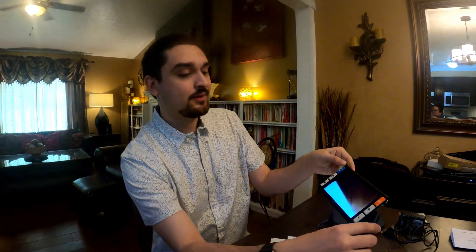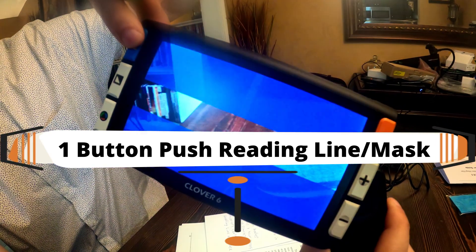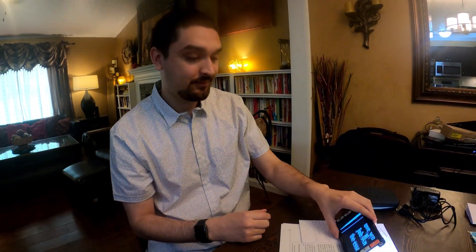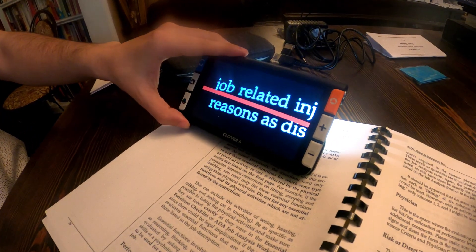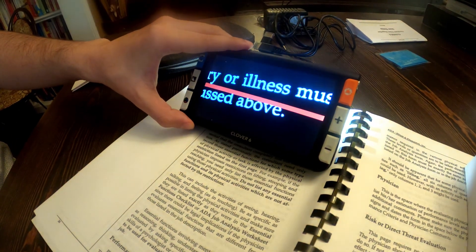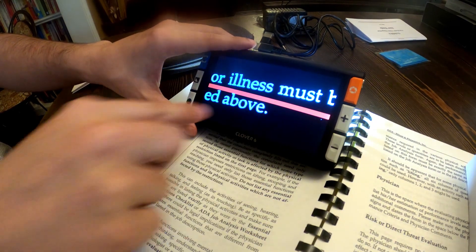The big thing I like on this one is if you push this blue button it will put a reading line on screen, and it has horizontal or vertical options and can also do masking the same way. So on this book, I've got my magnifier and reading line so I can see I'm at 'job related injury or illness must,' and if I forgot where I was I have my line to help me see where I was at.